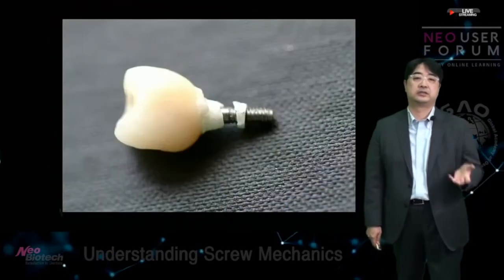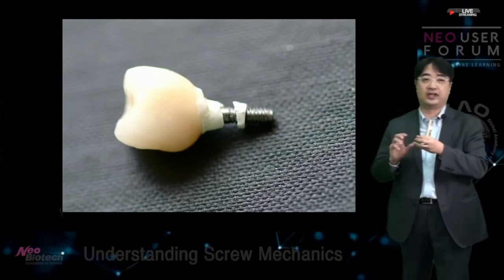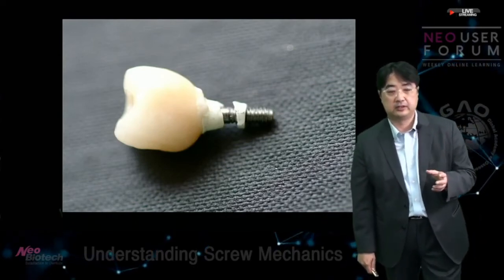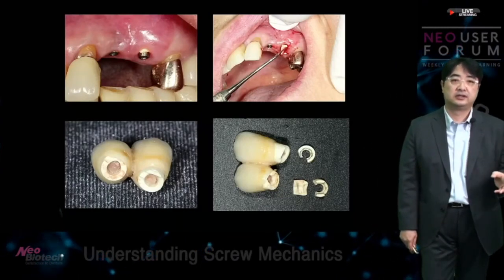Then the abutment broke. So what's going to happen is the zirconia abutment moves inside of the implant. That's a horrible thing, right? That may damage the inside of the implant. So with that, we have to worry. Even in an external case, a zirconia abutment can break, right?